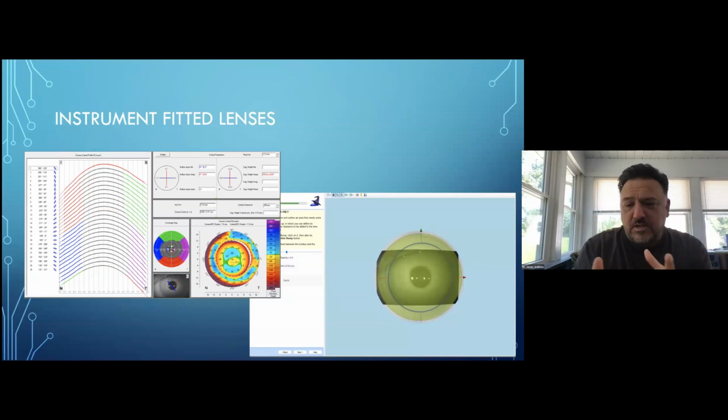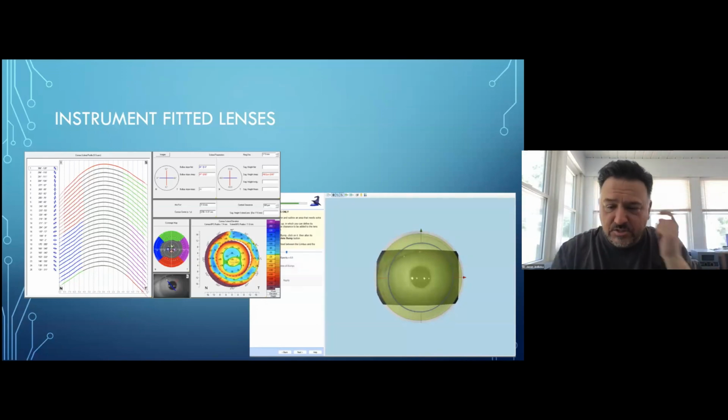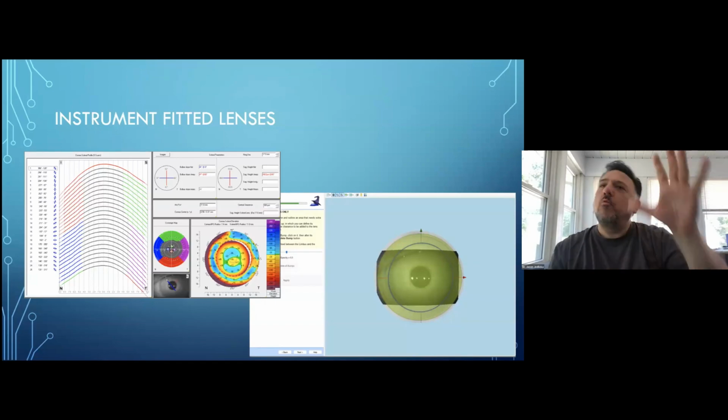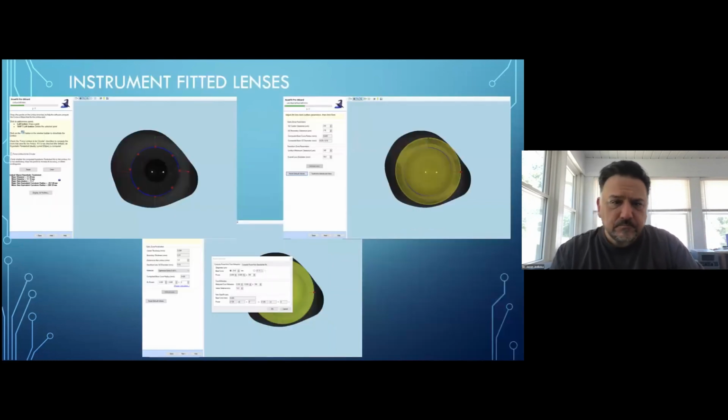And so again, this is another software program. We upload our map, and it walks us through a 7-step process or so to create that lens. Again, giving you as a fitter the ability to have some adjustment factors. If I want a diameter of a certain size, or I know something about this patient that I think is helpful to guide it in a certain way, and the software gives you something that disagrees with your thinking, you have the ability to modify that.